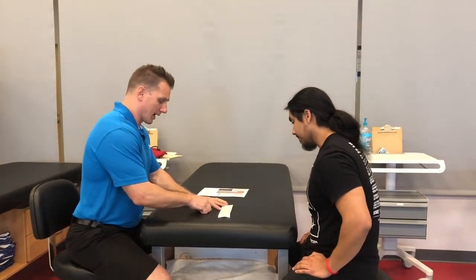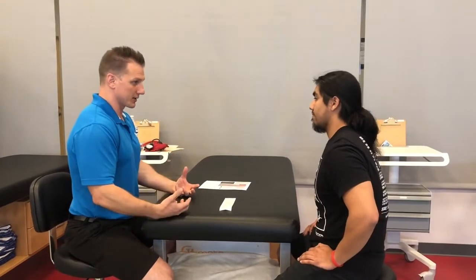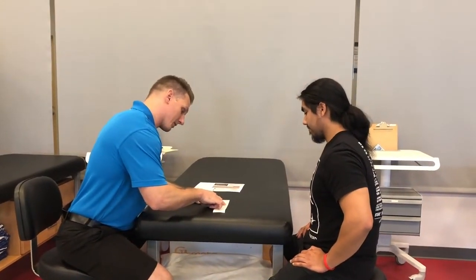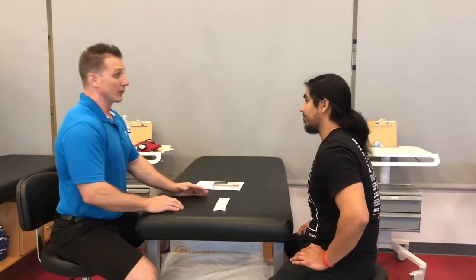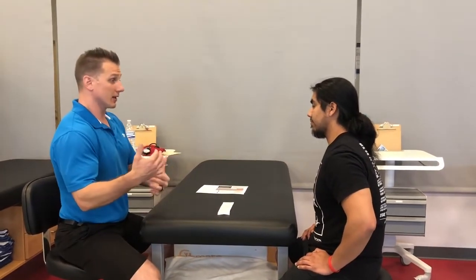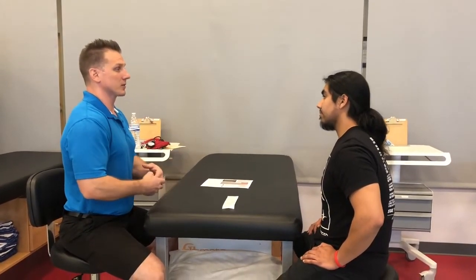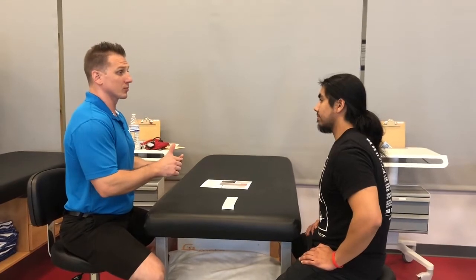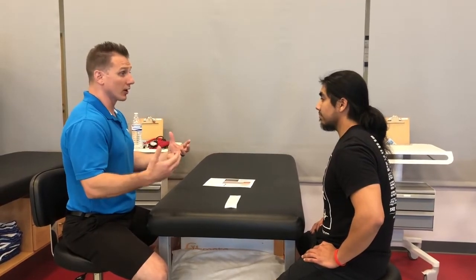We also have TBW — total body water. This gives us an idea of what your hydration status is. We take the total amount of weight that your total body water is, which here it says is 105.4 pounds, and divide that by 201.2 pounds, giving us a percentage of 52.4%. For males, we're looking at a normative value of 60 to 70% hydration status. So we'd want to help you increase that over months. You can get water through your food sources, obviously water, bottled water, and different types of juices and drinks. However, we want to encourage a healthy, positive way of doing this — so whole foods and water.